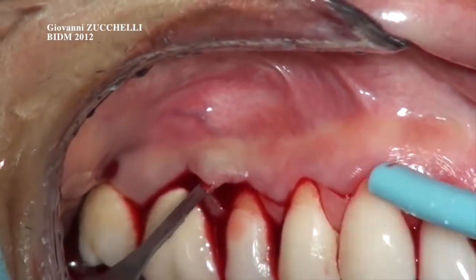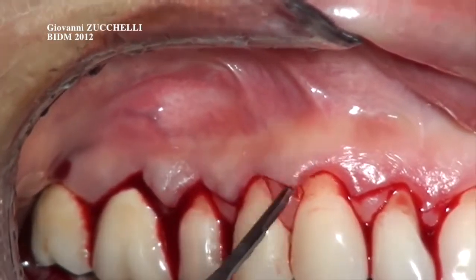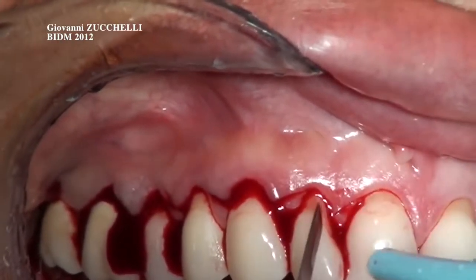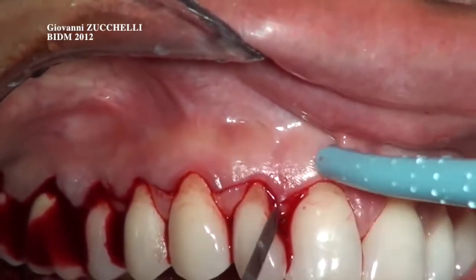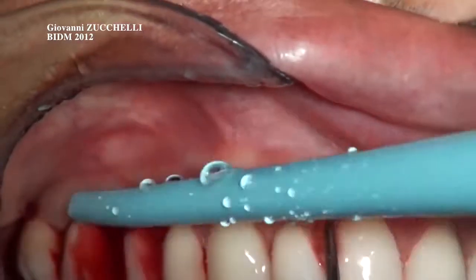So this is another surgical papilla. I have to follow the line until the tip. May I have some saline, please? Until the tip.